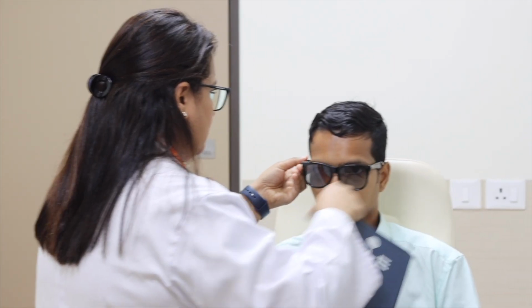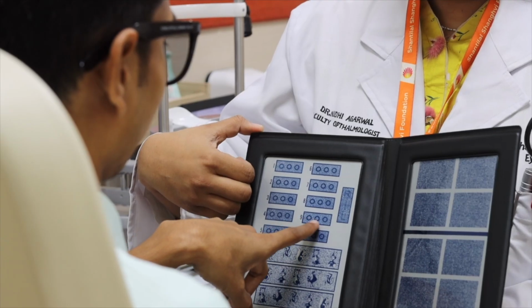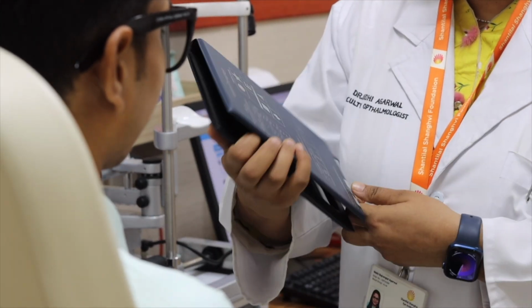Next comes evaluation of stereopsis, which can be done with Randot stereo test using Polaroid glasses. Now here the patient identifies 3D circle in each line and the value of stereopsis against the given line is mentioned at the back of the book.